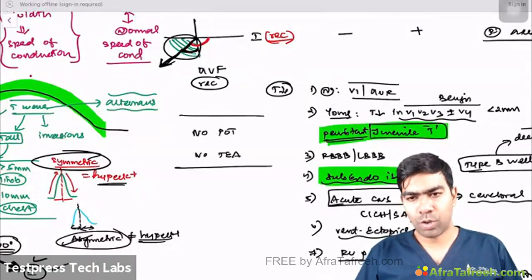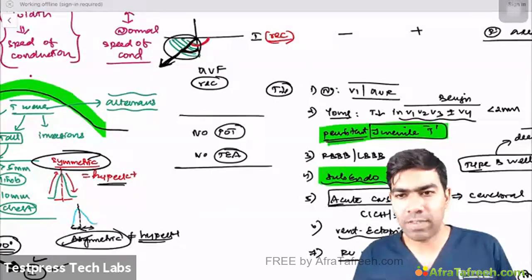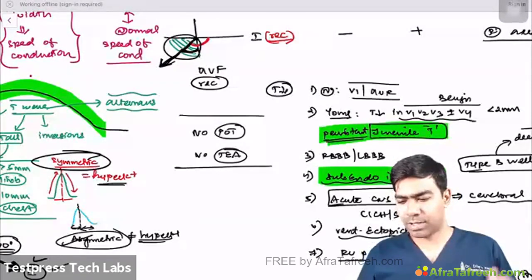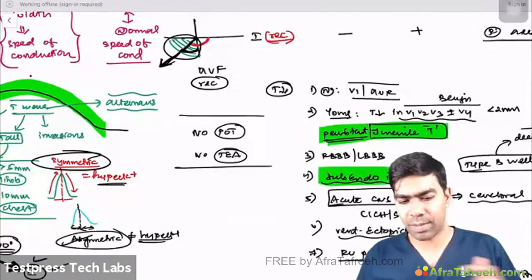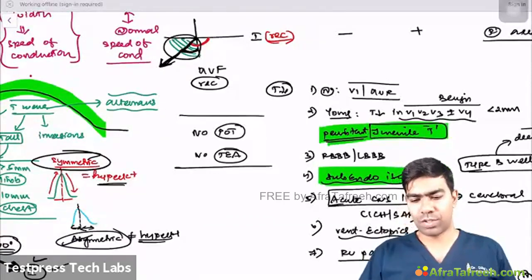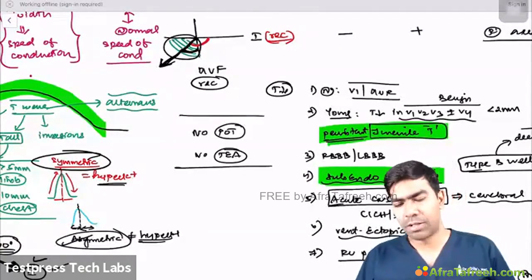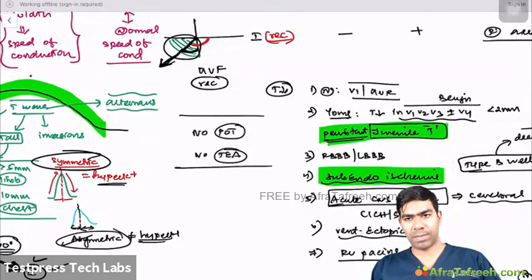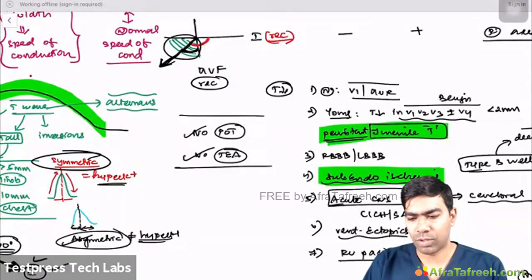No pot, no T. Which means if you do not have potassium, you don't get a T wave, so the T wave will get flattened, and T wave inversion will not happen. Basically, you will get ST depression, but U wave will come. That's why I didn't write hypokalemia in the T wave inversion causes. Usually hypokalemia is not a very important cause of T wave inversion. They produce ST depressions, but T wave flattening may be there. So that's the mnemonic: no pot, no T. So flat T wave is equal to hypokalemia. That's all.